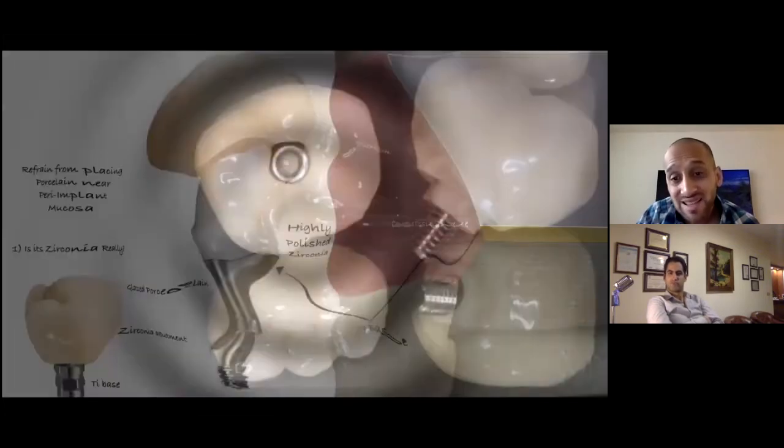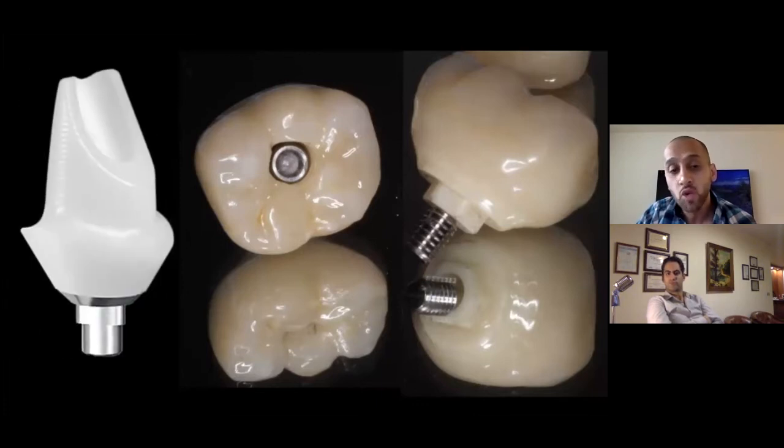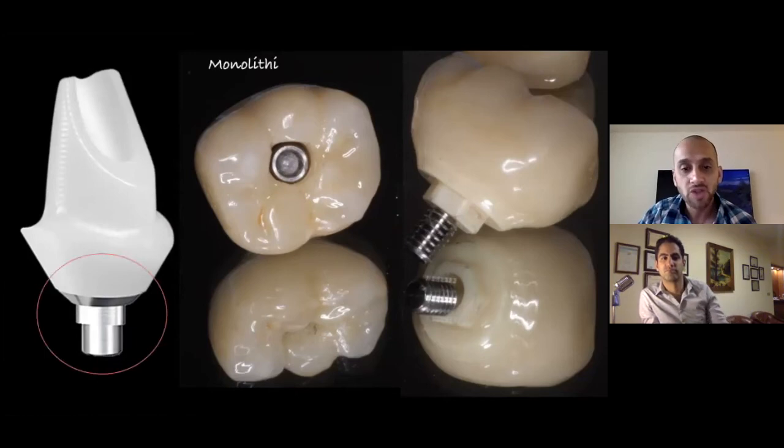In the past, this is an all zirconia crown that I did where the connection was zirconia. But then later on, people came and said that reaming the inside may lead to titanium tattooing and some titanium particles coming out in the sulcus. So we no longer do that. We use a titanium interface, but my recommendation is make that interface as minimum as possible and make the zirconia as maximum as possible. And that zirconia should be highly smooth, polished zirconia right over there. So how do you do that?